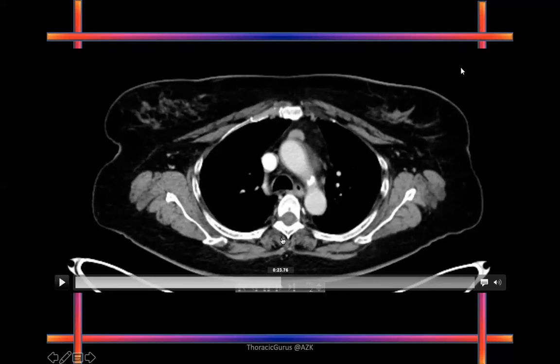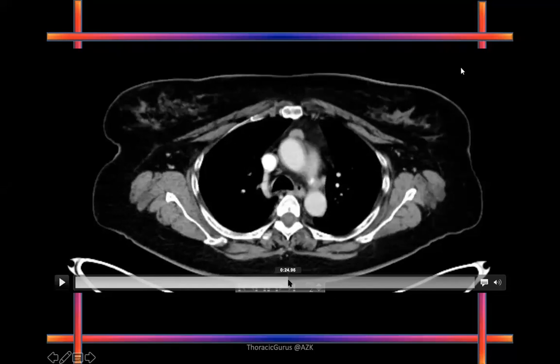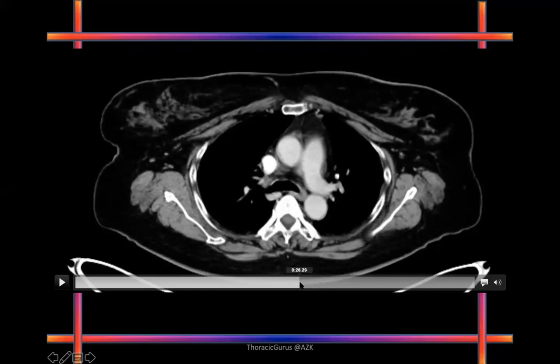So far, so good. Where would you see the para-aortic if you're looking here? Here, in front of this. Okay, here or here. Wherever, those are all six. Or at the arch, just in front of the arch is six. Again, it's para-aortic. Okay. One more question.